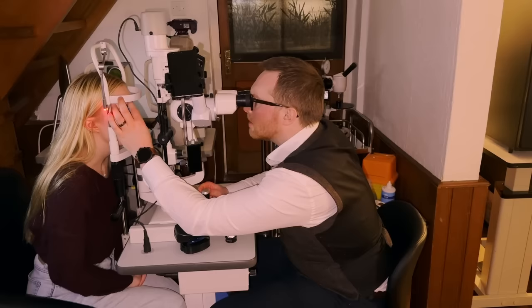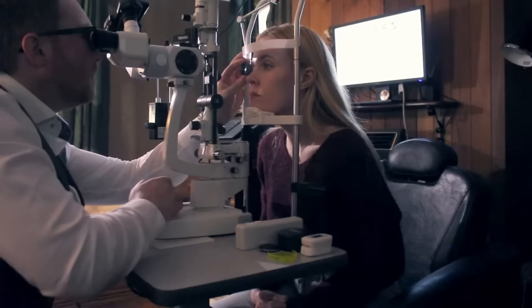And if I get you to look past my ear for me, and it's just going to get bright for a moment.